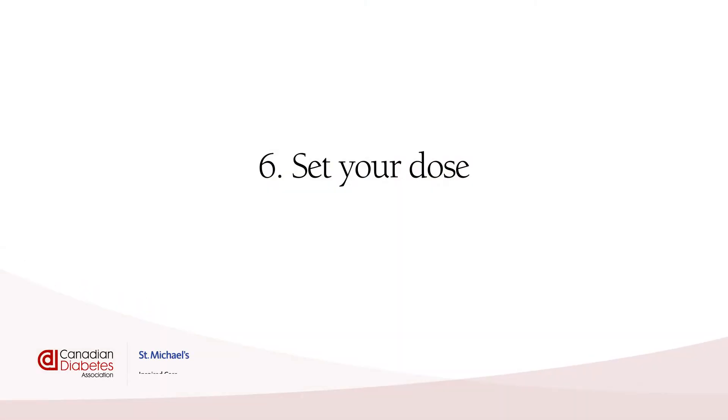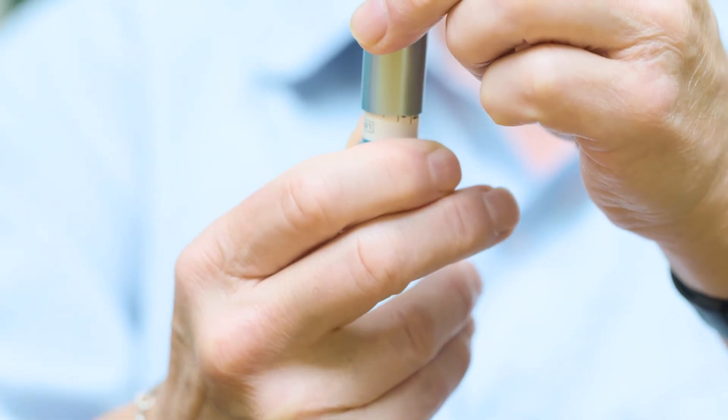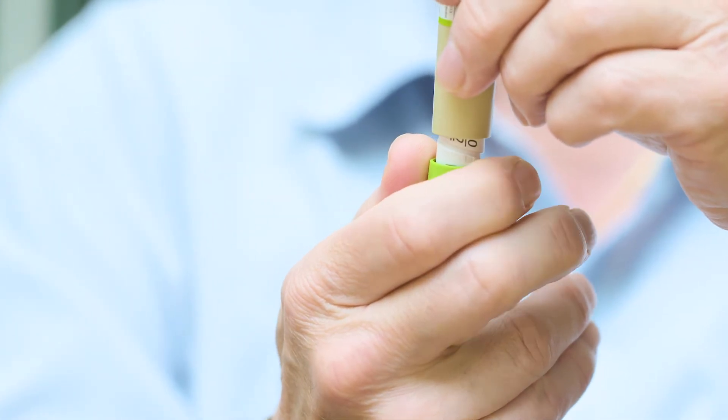Set your dose. The dial lets you set the amount of insulin that you need to inject. Just turn the dial to the right number. Remember that it shows just the even numbers, and all other numbers are marked as a line. If you're not sure what your number should be, talk to a member of your diabetes team about how much you should be taking.